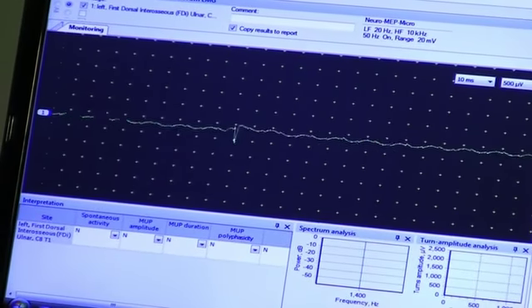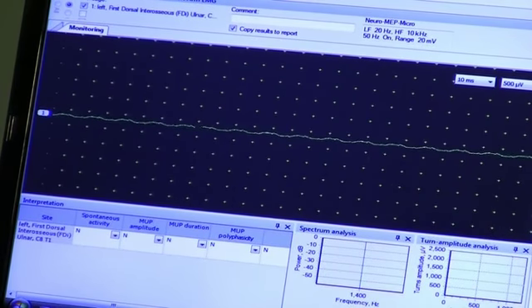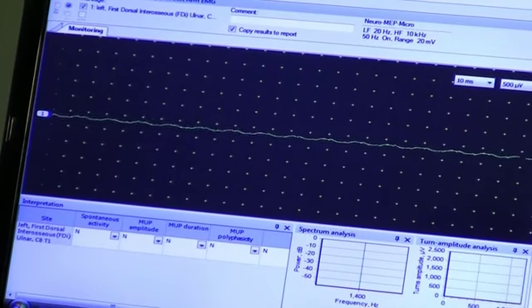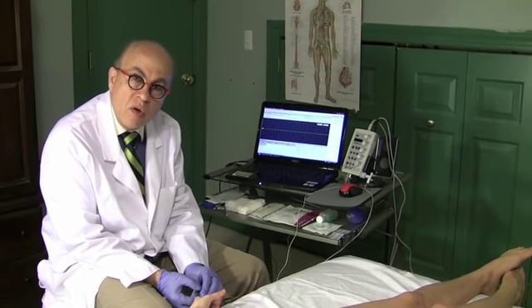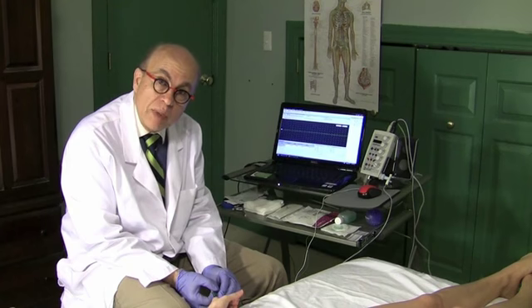You feel insertion, the muscle reacts, then it stops. It has to stop completely when you stop the insertion. If it does not stop, it might mean one of two things. Either you have hit the area where the nerve enters the muscle, and that's spontaneous activity, which is called end plate potentials, and these are perfectly normal, but they will hurt the patient. It will be painful. The patient will let you know.